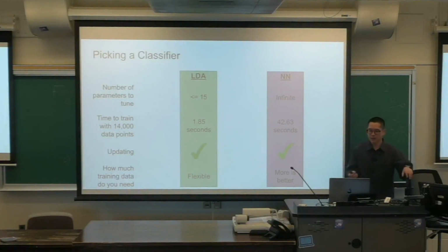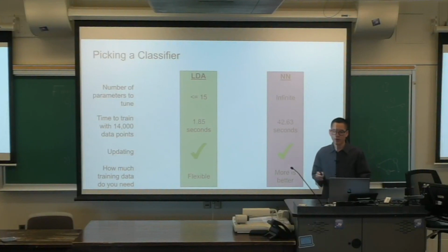The choice seems obvious, because the problem of neural networks being data thirsty does not change. If anything, it only gets worse because now we work with an even smaller initial data set. Also, speed matters because now we want the algorithm to work in an online fashion.